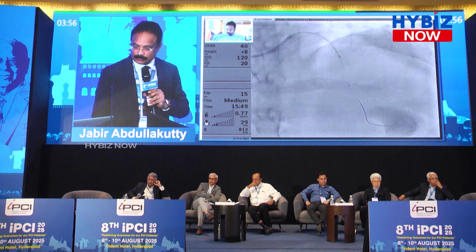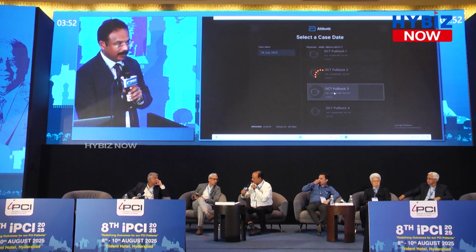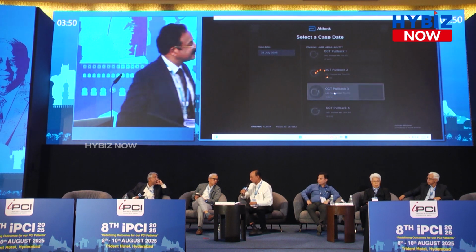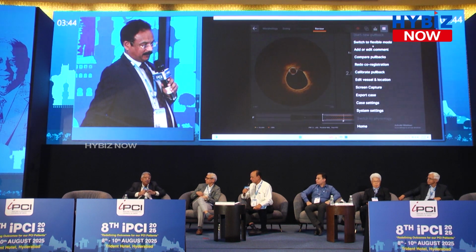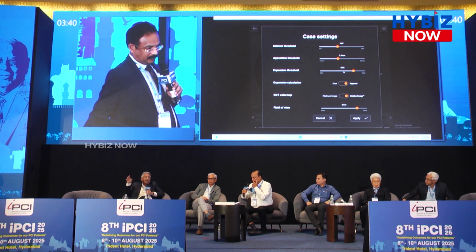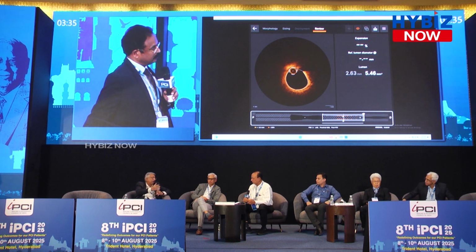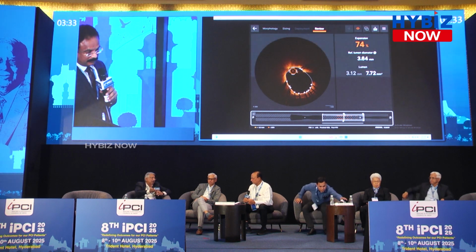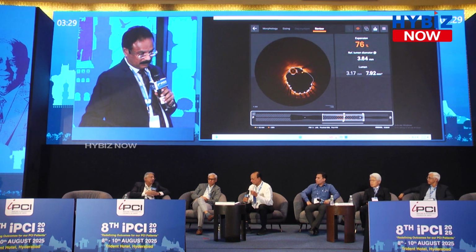And it did have an OCT, and go to the OCT. This is 3.5. Under expansion is acceptable. See, Illumin 3 used 90%, but I think what's accepted now most is 80%. But it's very important to understand also that in most of these trials, an expansion criterion of 80 or 90 was reached only in 40 or 50% of cases. I think you're not going to be able to reach a 90% expansion in most cases.